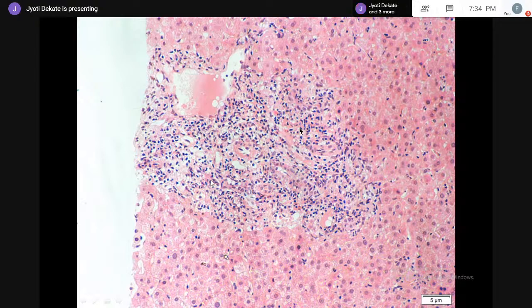Then there are these lymphoid cells, some of which are slightly larger than these mature appearing lymphocytes and have vesicular nuclear chromatin, like here, and there are many scattered eosinophils. So by now, if you have heard my previous talk, you will know that this is the typical mixed inflammatory milieu which we see in cases of typical T-cell mediated rejection.